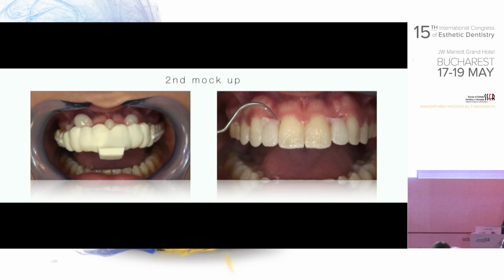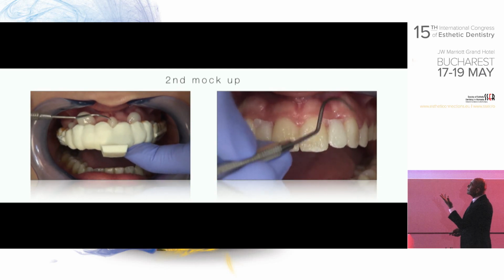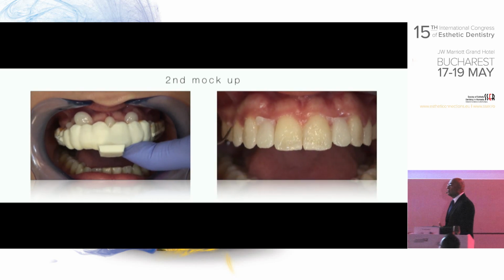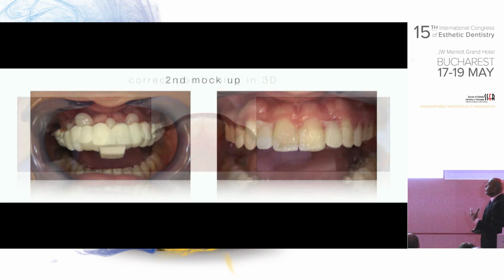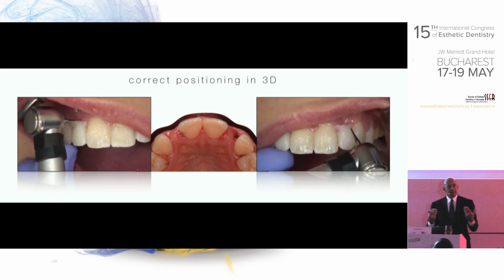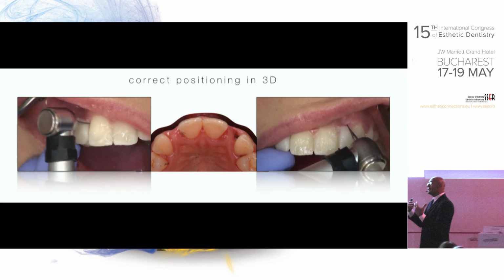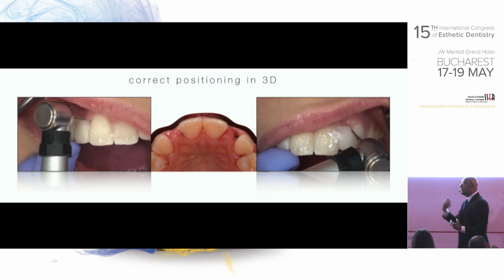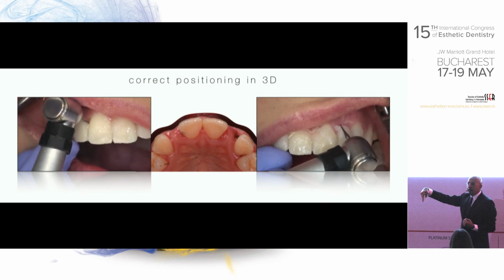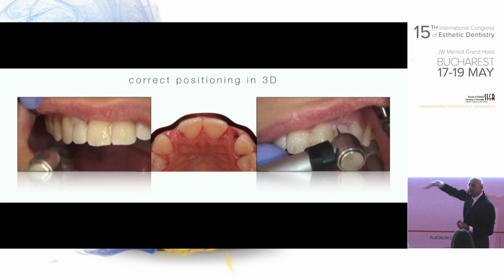Look at the margins. The only thing which is not perfect here is the laterals. There is some excess there. So why is that? I made the best tray, best impression, best transfer. Well, the reason for that is that, remember, we had a tissue loss there. So regardless of where the tissue is, because we're following the aesthetic design only, Hilal designed the lateral with the correct vertical inclination. If he would start the design from the soft tissue, it will look like this, flared out.